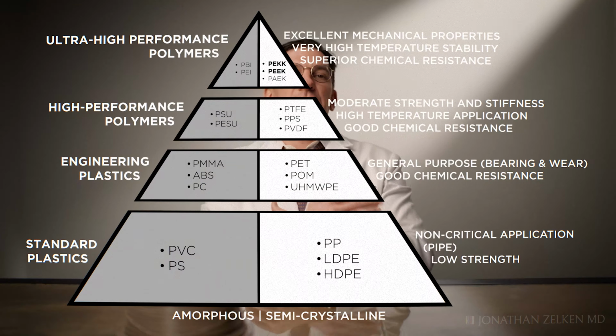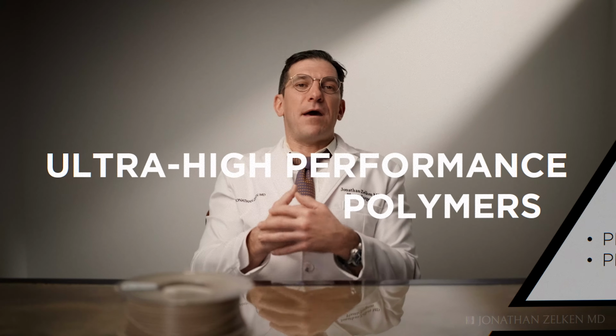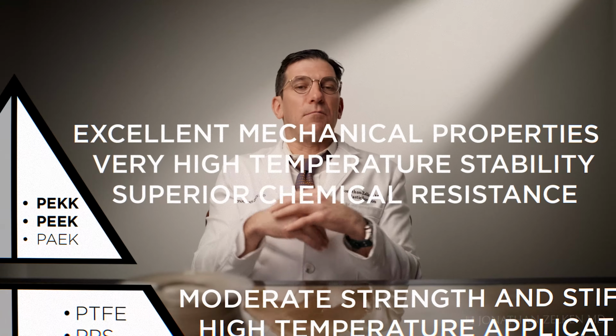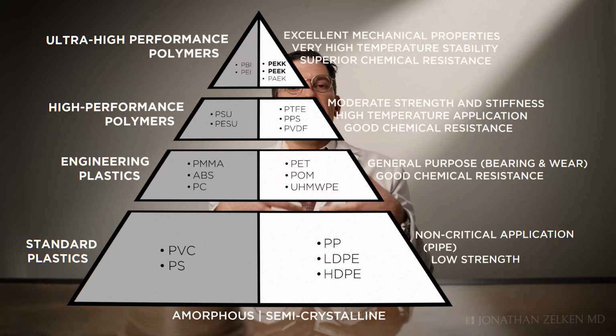Companies that manufacture PEKK implants say that it has better resistance to microbes and things like that as well. It's microporous and they can be better in some ways. However, PEKK implants are just not as commercially available. Both have been used as implants in neurosurgical and craniofacial applications since the 1980s, and we have a long track record of showing their biocompatibility, so they are both solid contenders.